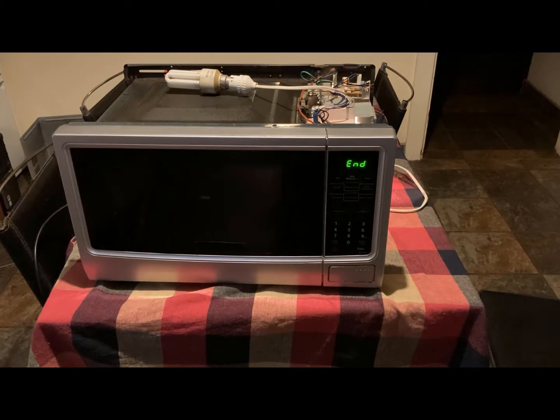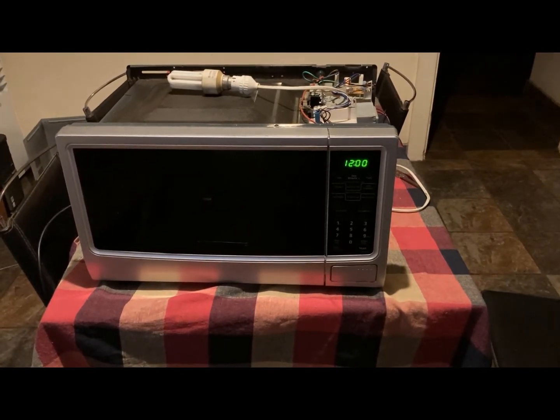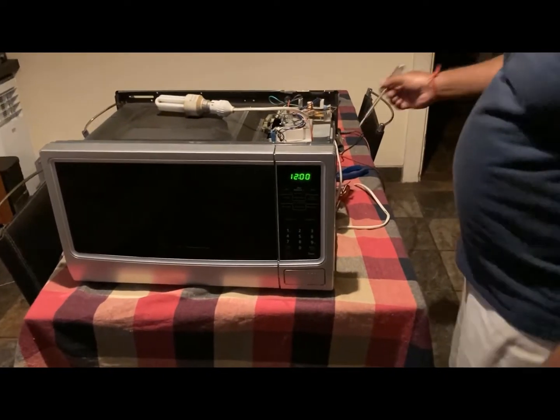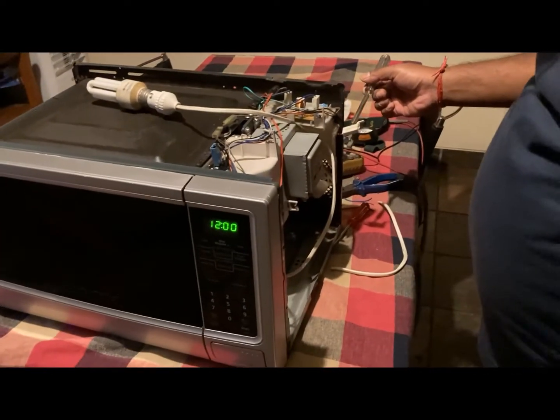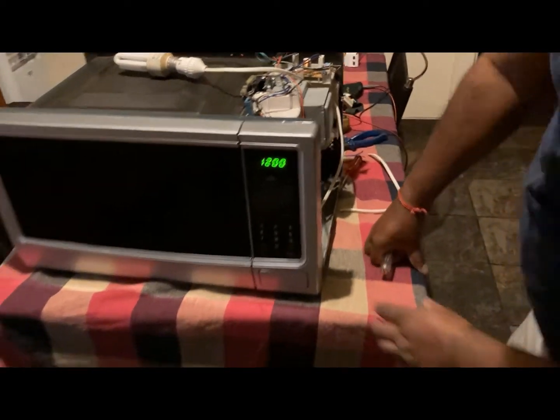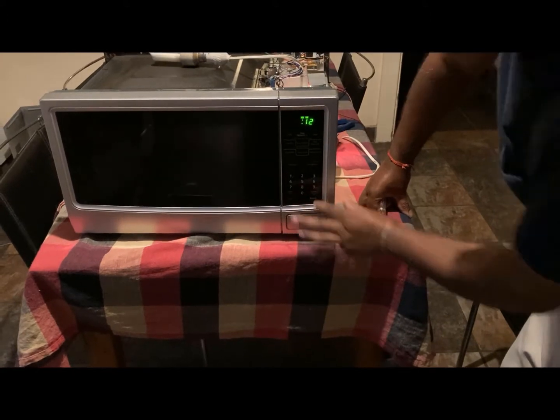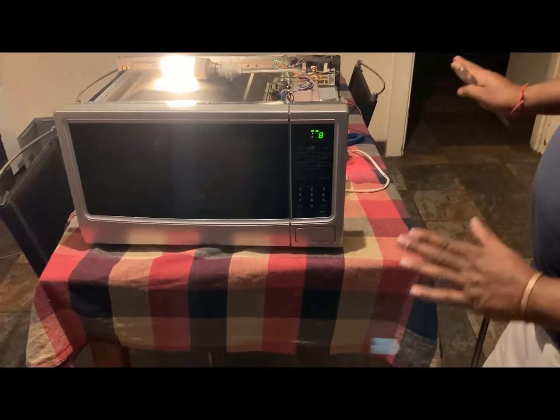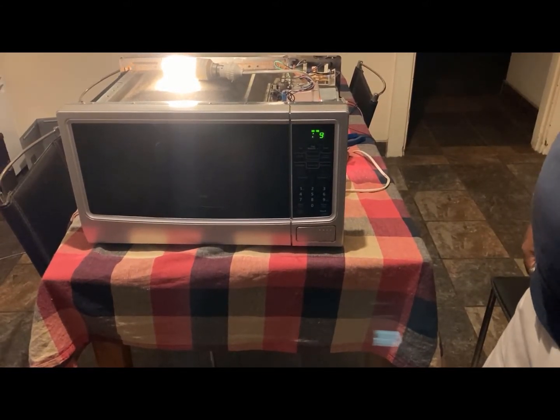After 12 seconds, this globe is going to be definitely off, and this means that this thing is working. The only thing is I need to disconnect the fan so that it doesn't make that noise. So I pulled the plug out for the fan, which is here. I will leave it like this, and now I'm going to put my 12 seconds again. Second and start. Okay. Now your box doesn't make that noise, but it will beep once it's done. It will tell you it's done.